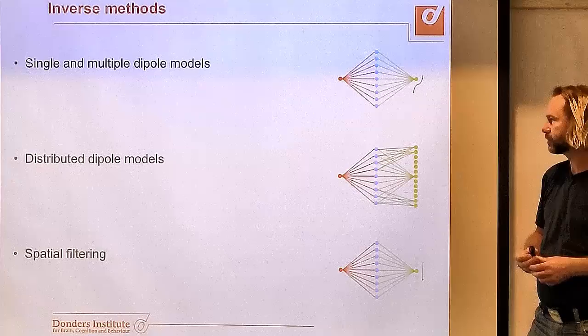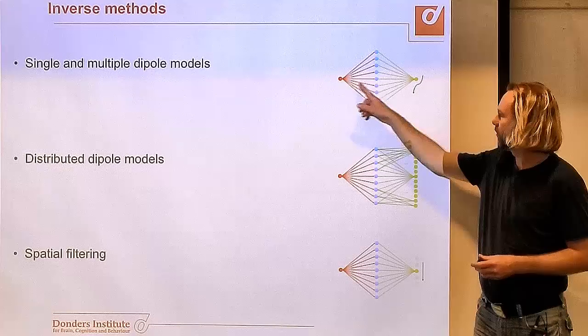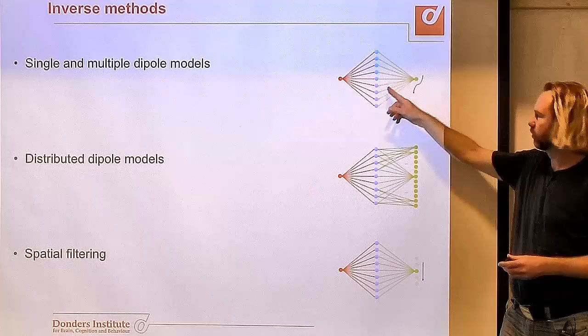If we use dipole fitting, what we do is we have a source that is projecting on the channels and we have a model for which we can also compute the data on the channels and we can fit the dipole around until it optimally matches. That's what we've seen yesterday.